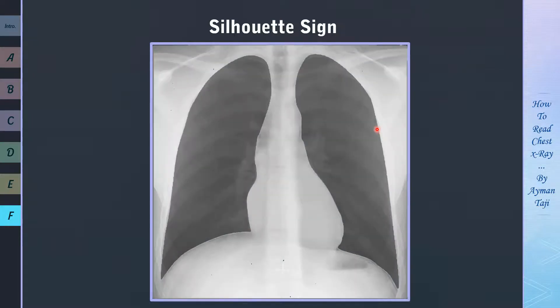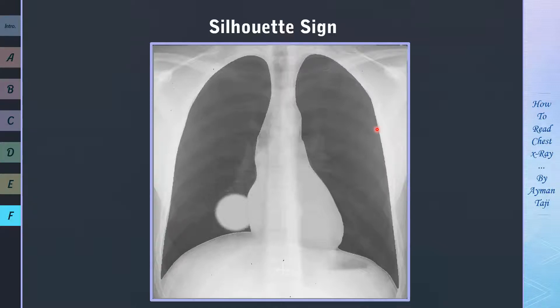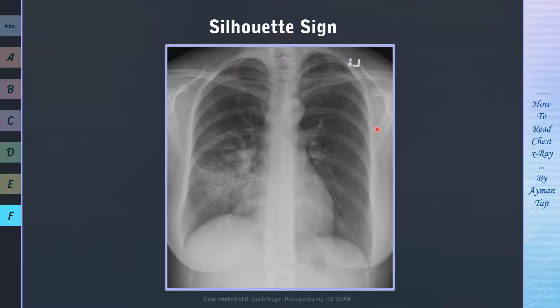Now for the silhouette sign. Normally, the heart and lungs have different radiographic densities, which give the heart and mediastinum a clear contour. The silhouette sign occurs when two objects of the same radiographic density — such as water and soft tissue — touch each other, so the edge between them disappears and it becomes impossible to tell where one object begins and the other ends. Basically, the silhouette sign is somewhat of a misnomer — it's actually the loss of the silhouette. As an example, this patient had pneumonia in the right middle lobe, which caused the silhouette sign to appear on the right border of the heart.